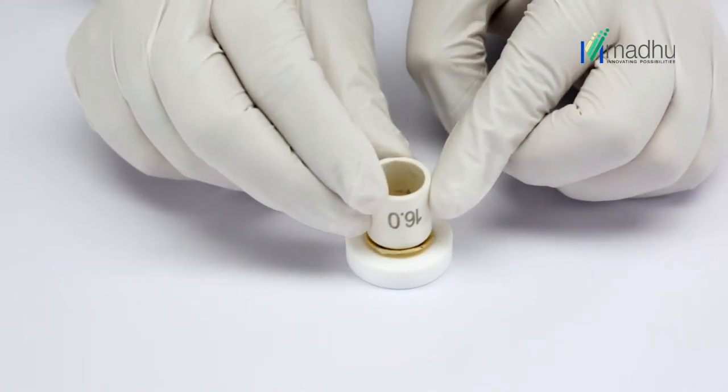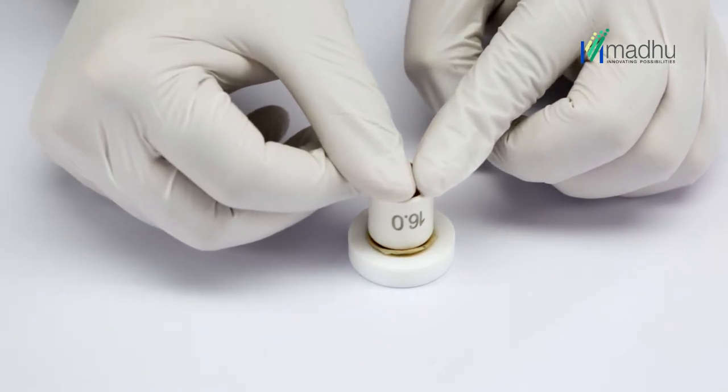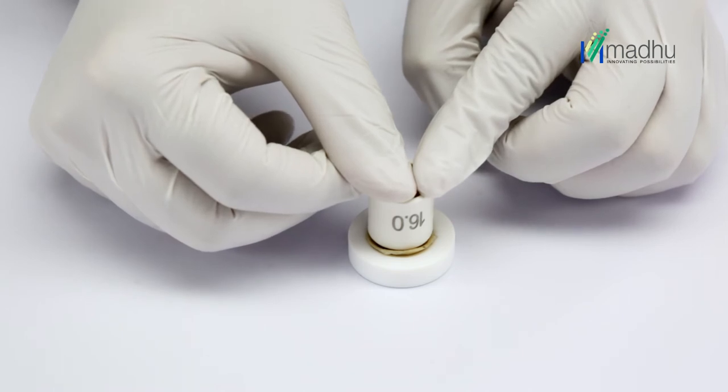Place fingers or thumb directly over the trephine blade shell base and press down firmly. The donor corneal or corneoscleral button of desired diameter is now ready for use.